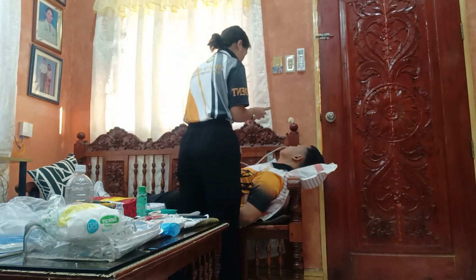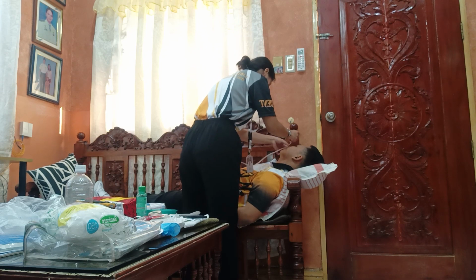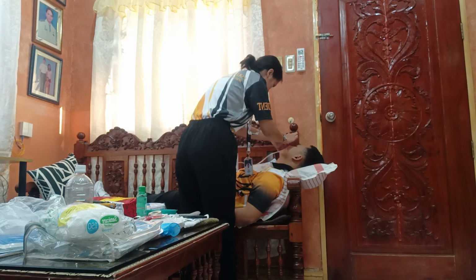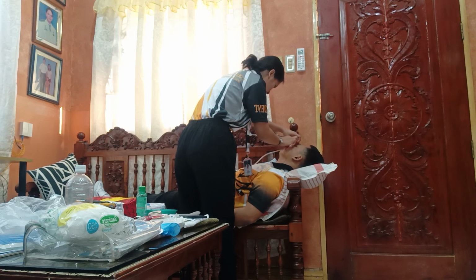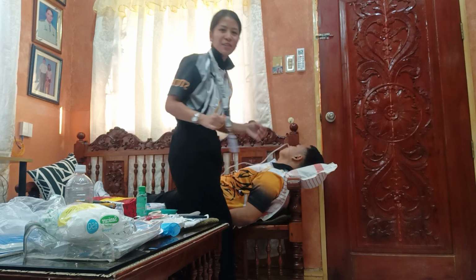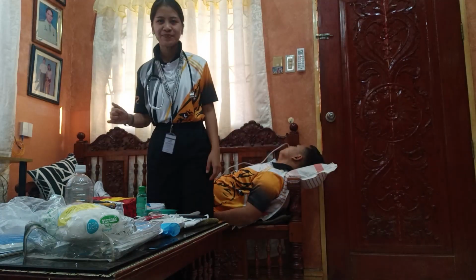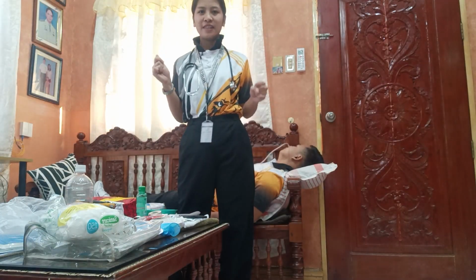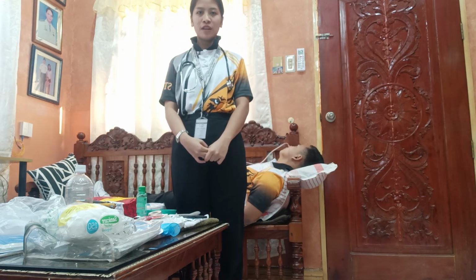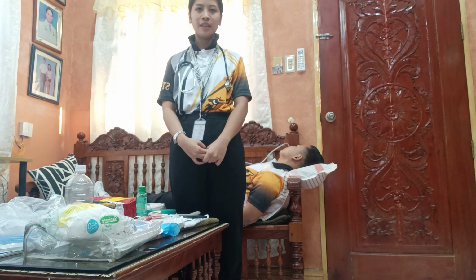Ito, and then okay po. And after that is wrap the split ends under the tubing and up and over onto the nose, and also be careful not to fold the tube too tightly against the nose.